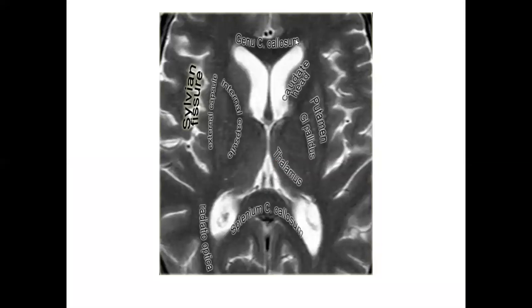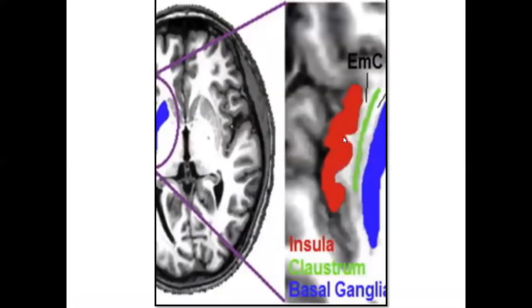You can see the genu of the corpus callosum, lateral ventricle, caudate nucleus head, thalamus, globus pallidus, and putamen — globus pallidus and putamen together forming the lentiform nucleus — and this is the insular cortex. In a color-coded view, red is the insular cortex, this is the claustrum, external capsule, and these are the parts of the basal ganglia — that is the putamen.